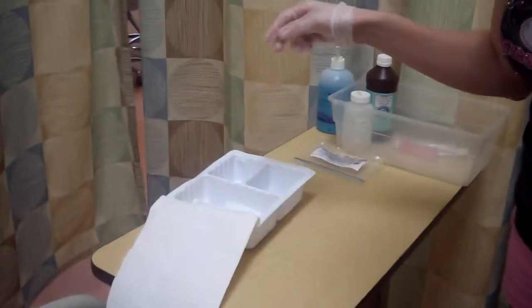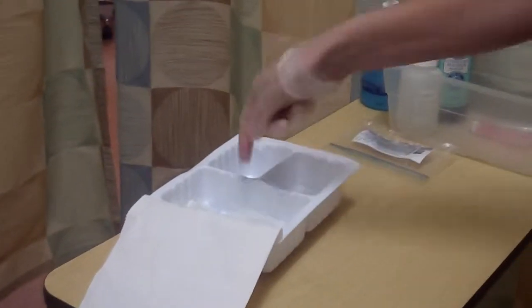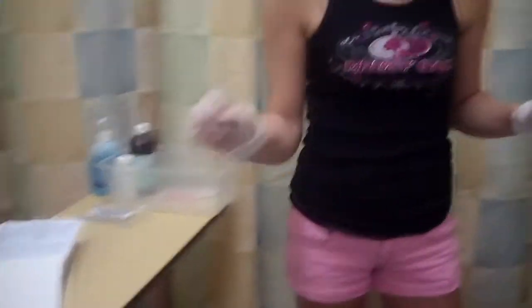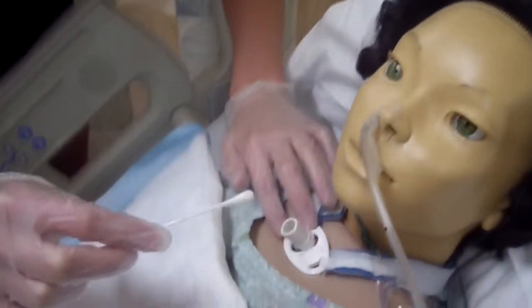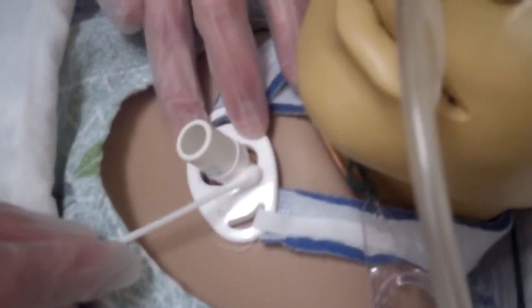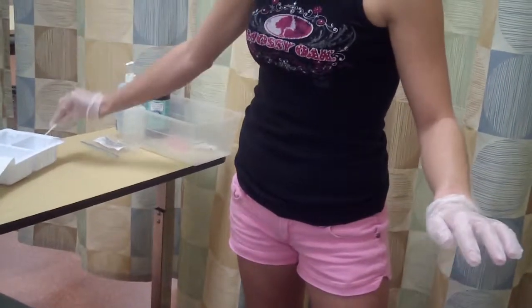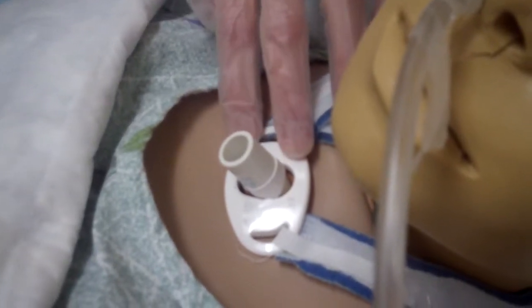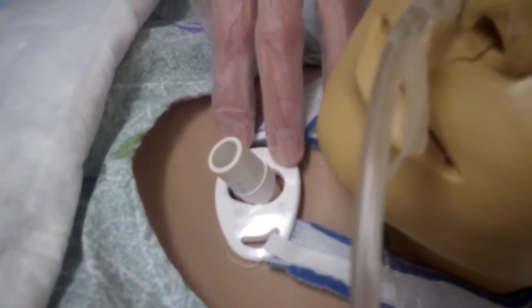And I'm going to come back over to my sterile field and with my dominant hand grab a Q-tip, dip it into the saline and come over here and clean the top of the faceplate. I'm going to use the Q-tip and roll from the stoma outward, using it only one time. I would throw it away, grab a new Q-tip, dip it in the saline, come over and roll stoma outward once again. I do that as many times as necessary to clean the top of the faceplate.